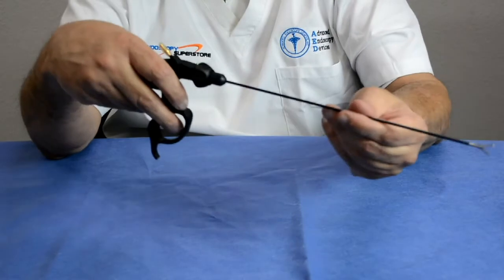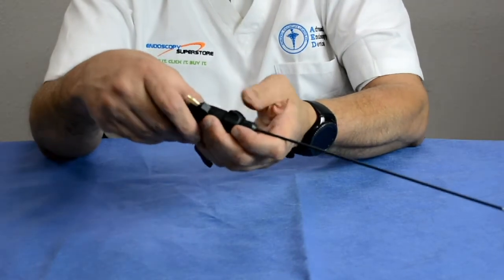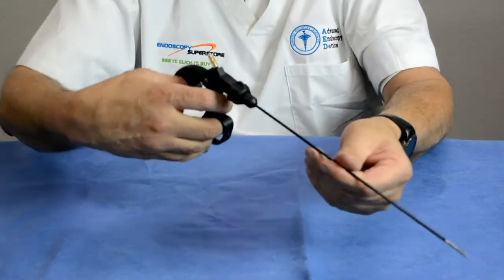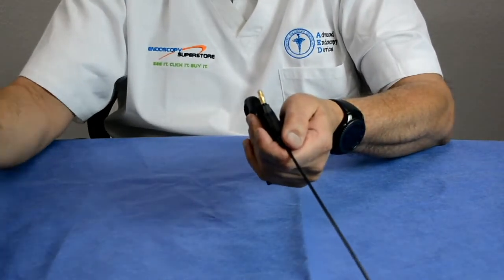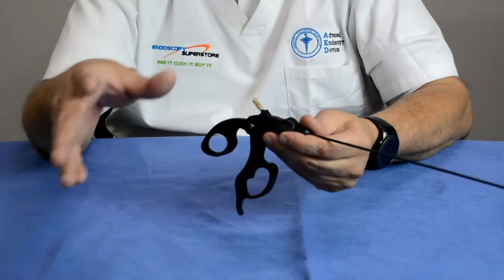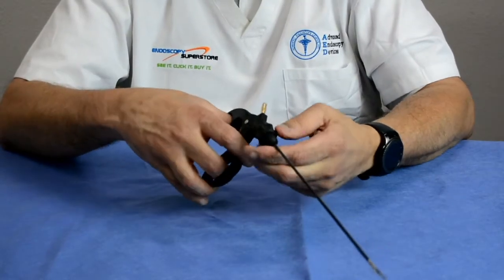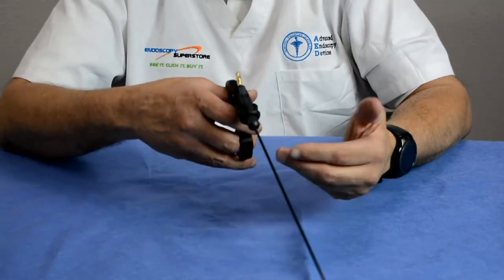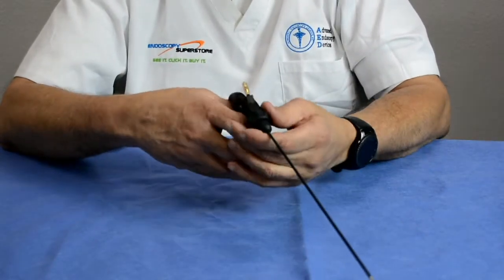One of the next innovations in laparoscopic instruments was changing the diameters. When working on adolescents, very thin patients, or patients where larger ports risked herniation, instruments that went down to two or three millimeters became available. The standard forcep when first developed was five millimeters, and there were even ten millimeter versions. But many doctors found that larger instruments increased the chance of causing hernias, so smaller diameter instruments — from two to five millimeters — were developed, making procedures less traumatic for the patient.